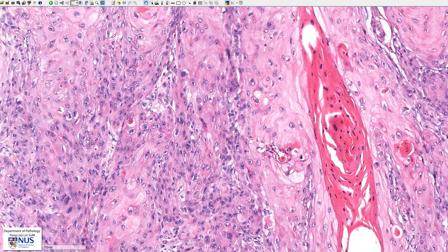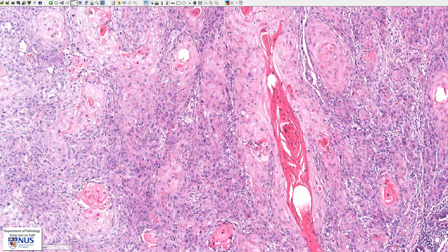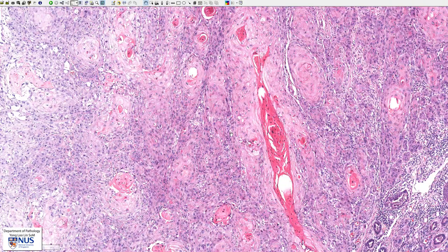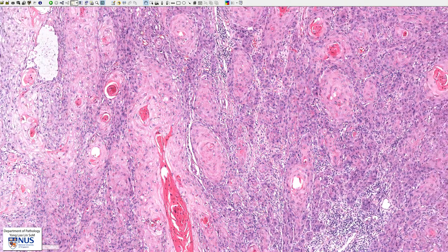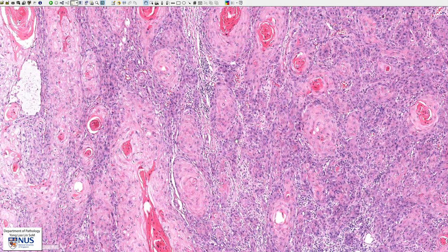There are some features that tell us that this is a squamous cell carcinoma. Firstly, the architecture of the malignant cells — they tend to form solid sheets and nests, and we don't see any gland formation or any lumen formation.